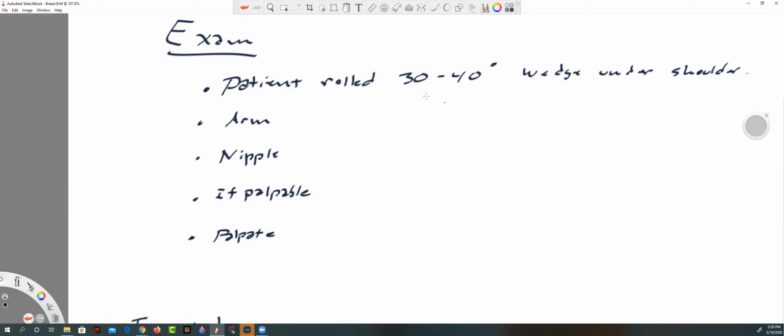And the one obvious reason for this, especially with larger breasted or older women with very fatty and soft breasts, you don't want to be scanning off to the side of the bed. You want to be scanning on the patient.